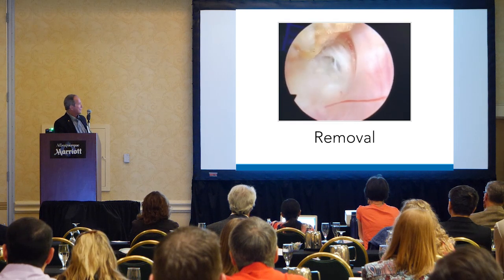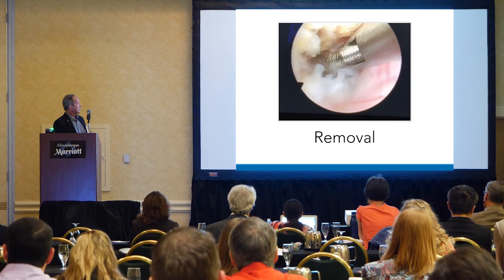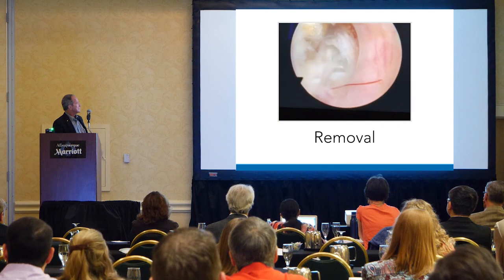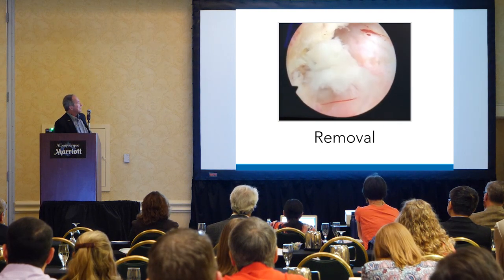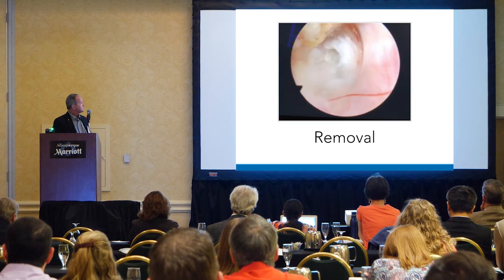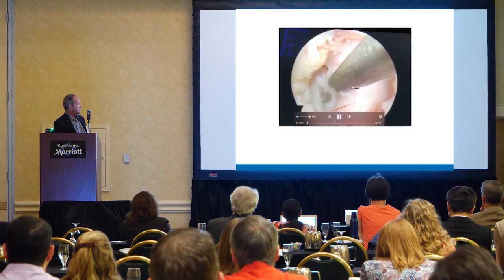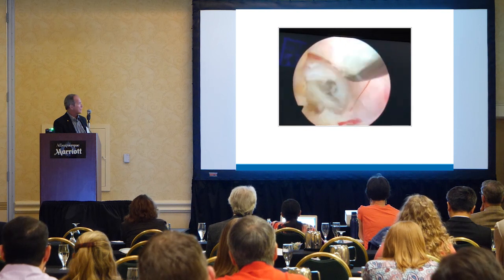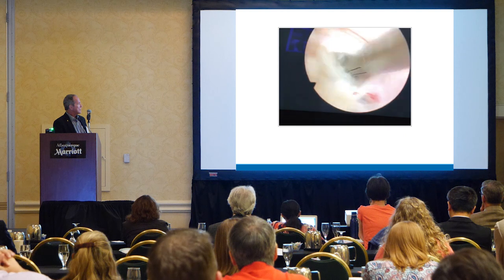Okay, let's keep removing the disc fragments. It's kind of just a matter of reaching in and pulling out. Again, there's the shoulder, so to the left is cranial. This is the basket forceps to just be sure to cut the remaining portion of the posterior longitudinal ligament and the annulus to be sure that there's no other hidden pieces there.